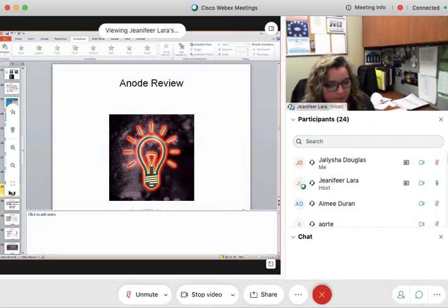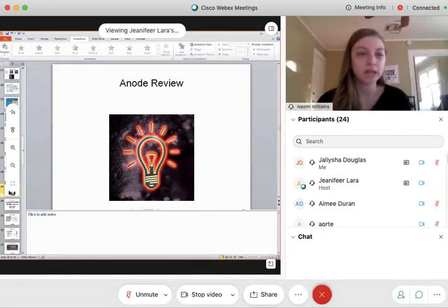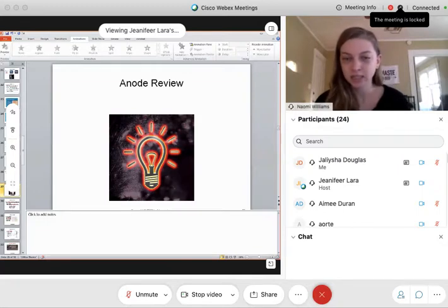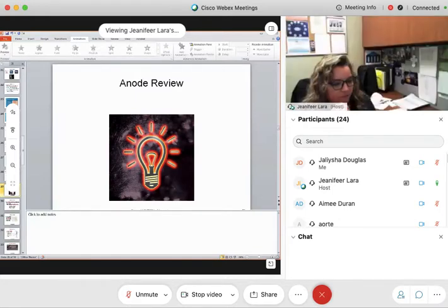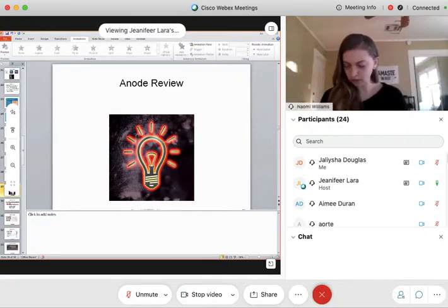Let's see. We have two different options. Of course, right now we're talking about a rotating anode, but there's also stationary. Good. That has what kind of shaft? What kind of element is in that shaft? Silver colored tungsten.